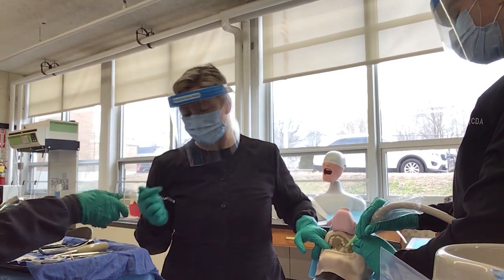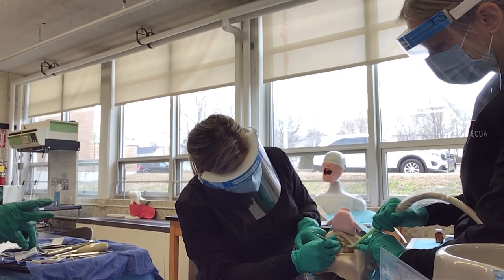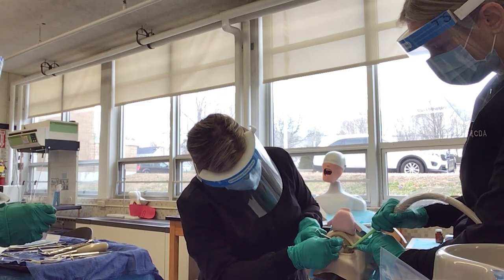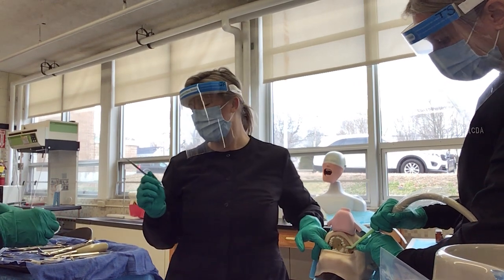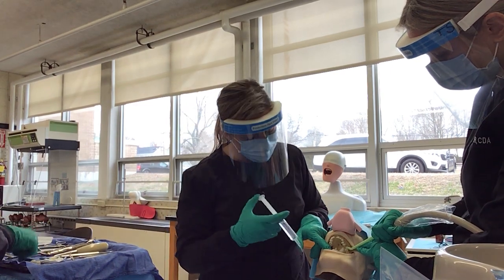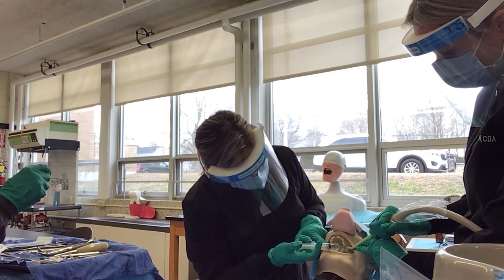And then I'm going to ask for a curette to help clean out and debride that socket. And Mrs. Santos is getting all the stuff that's coming out of there, so it could be like an abscess, any fragments of tooth or bone, anything. I'm going to get that nice and clean, and then I'm going to ask for irrigation. Thank you. And we're going to irrigate that socket.